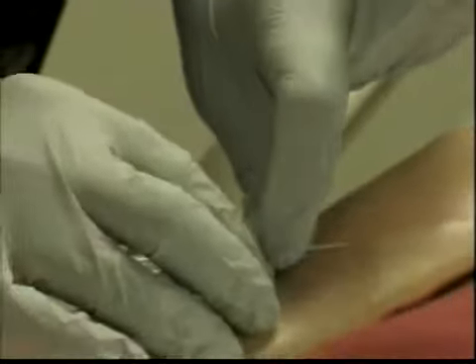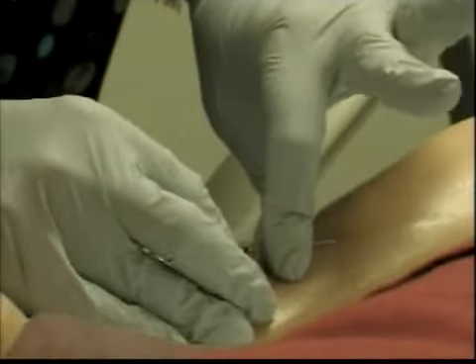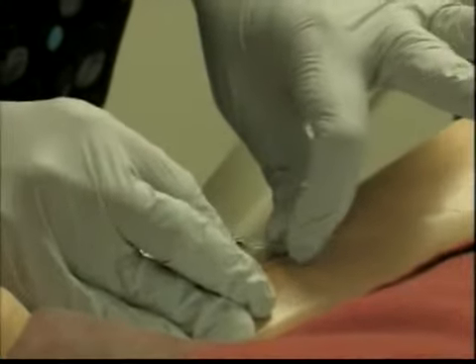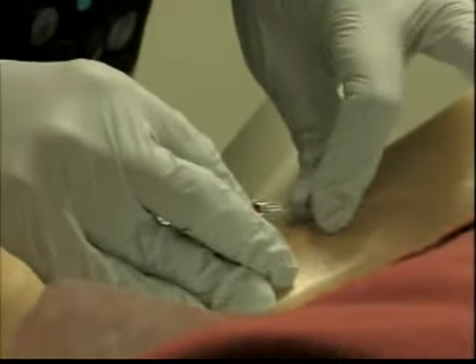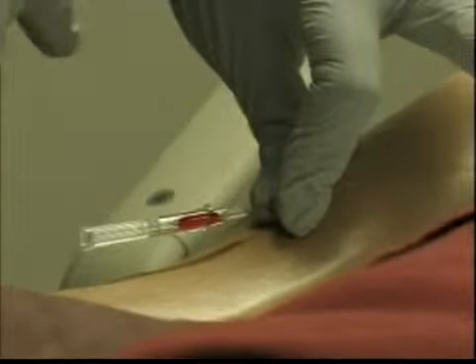Okay, so you will be advancing the catheter at the same time you're removing your stylet. You see that? We keep on doing so until we put the catheter all the way through. Now we're holding steady. You see how my fingers are holding this steady right at the hub. It's not getting contaminated. We remove the tourniquet. We have our thing ready there to go.